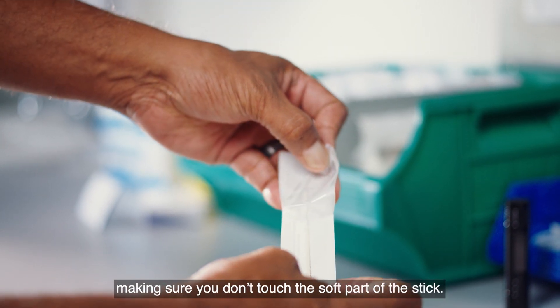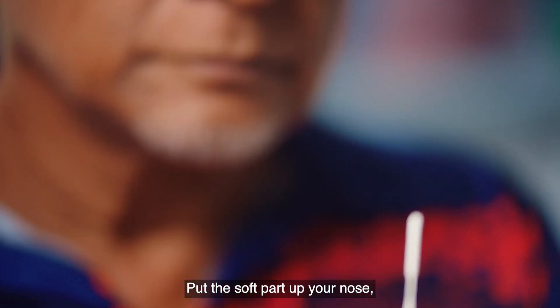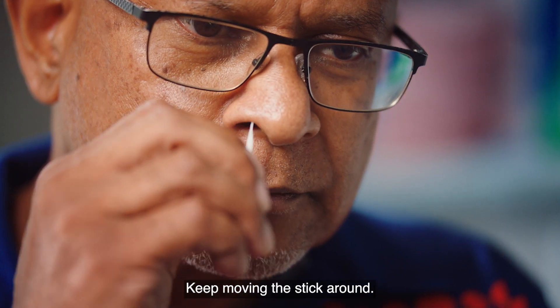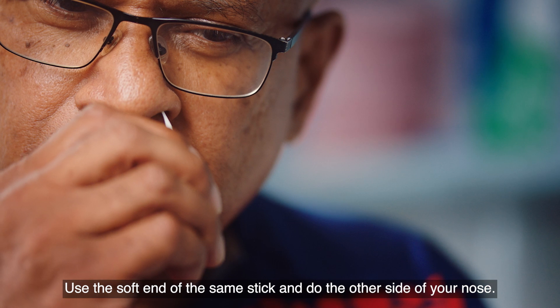Take the stick out of the packet, making sure you don't touch the soft part of the stick. Put the soft part up your nose all the way up until you feel it touch the back of your nose. Keep moving the stick around. Then use the soft end of the same stick and do the other side of your nose.